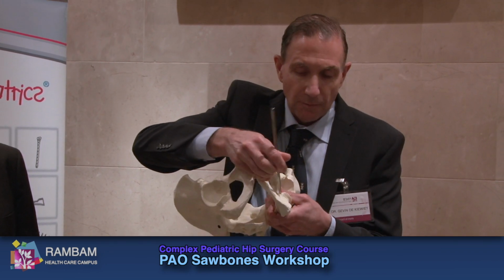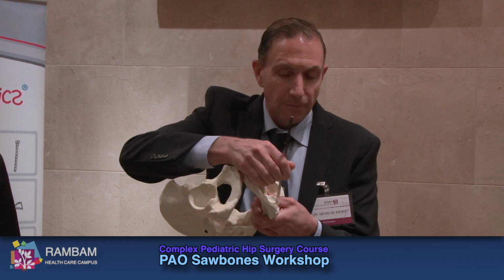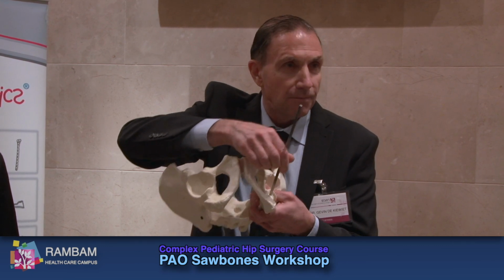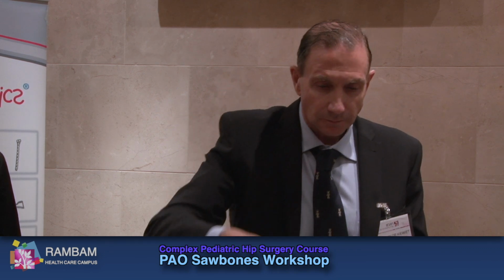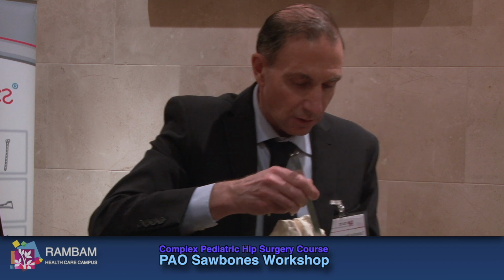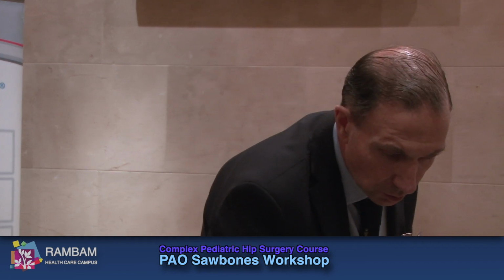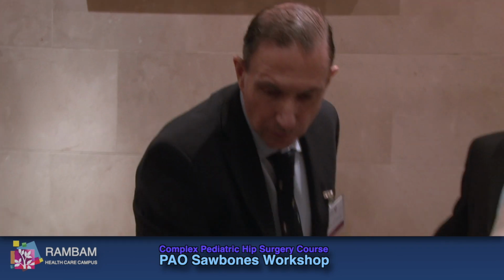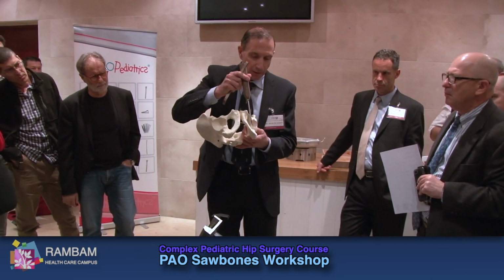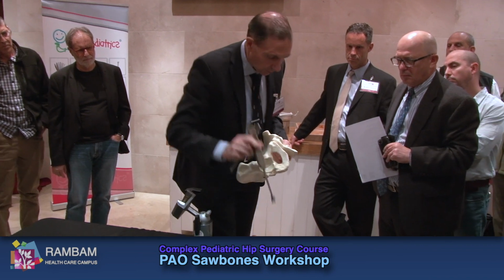That's what you want to select because the vessel is coming across here. The inferior blood supply is coming through here. The obturator vessel is coming in here into the acetabulum. Up onto that. That's where the ischial osteotomy is going to be. You're taking a curved osteotome. To do this, the Ganz osteotome. One of these ones, or either one of these ones, or that one that was shown on the X-rays, which is pointed, will come in here, and with the narrow one.